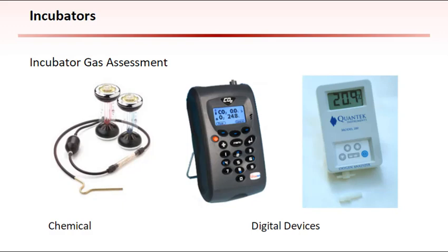CO2 and O2 determination is not quite as easy in benchtop models compared with big box incubators. However, there are a number of smaller devices that can be used. This is where using premixed gas is an advantage. The College of American Pathologists has stated in their checklist that certificates of analysis are satisfactory evidence of gas mixture identification, so the use of secondary measuring devices is not required when using premixed gases.